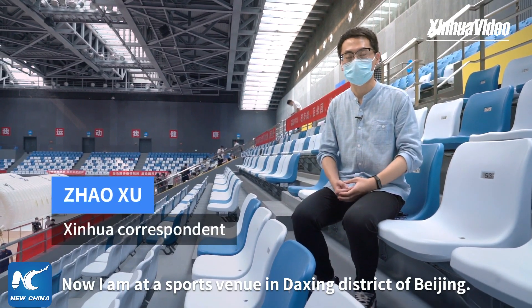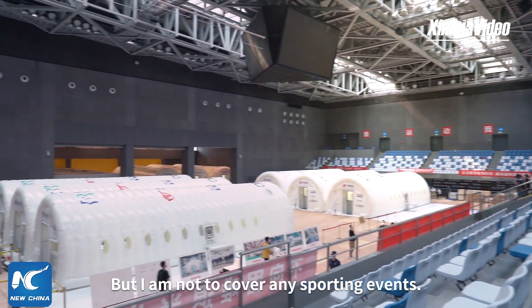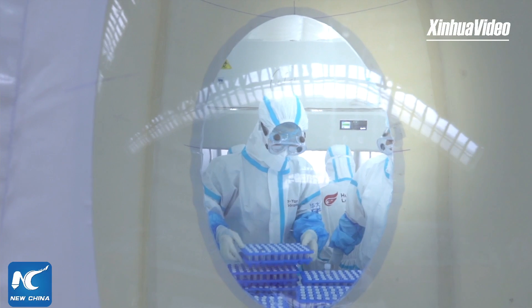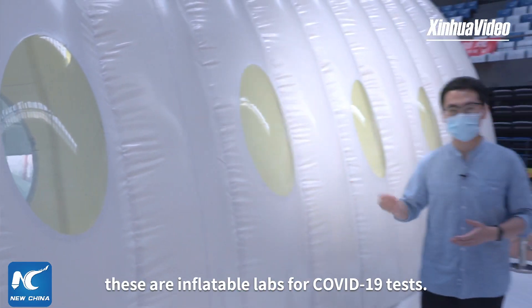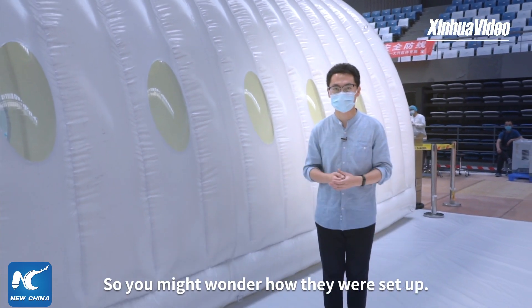Now I'm at a sports venue in Daxing District of Beijing, but I'm not here to cover any sporting events. Named Huoyuan, or FireEye in English, these are inflatable labs for COVID-19 tests, so you might wonder how they were set up.